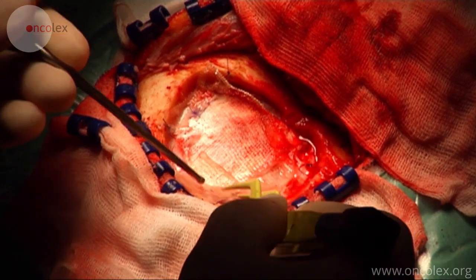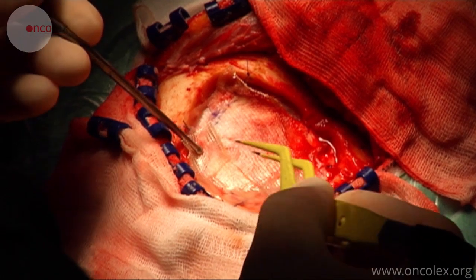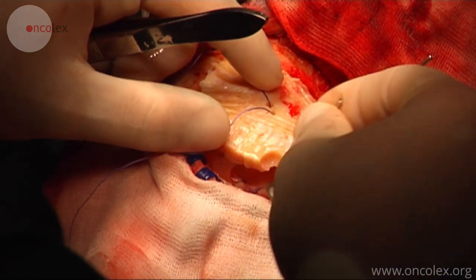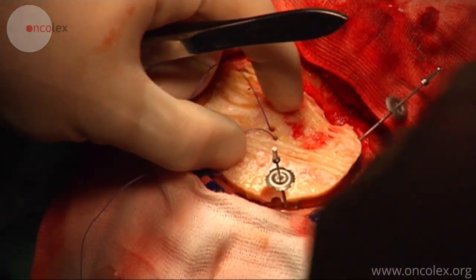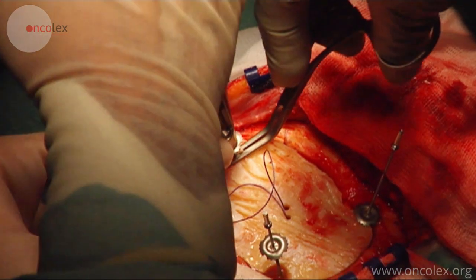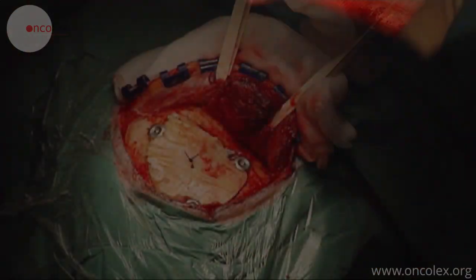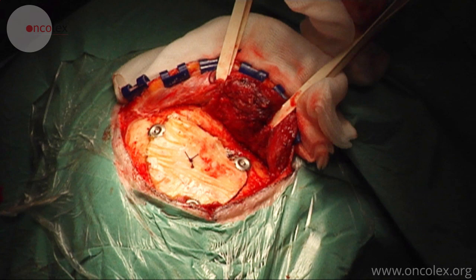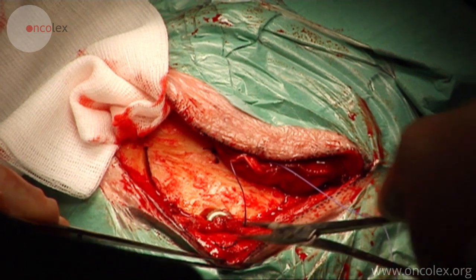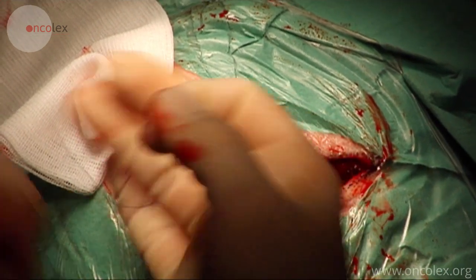The suture is attached to the drill hole in the bone flap to prevent the accumulation of blood between the bone flap and the dura. The bone flap is attached to the cranium with three craniofix screws. The muscle and epicranial aponeurosis are stitched back over the cranium, and the wound edges on the outer skin are closed with staples.